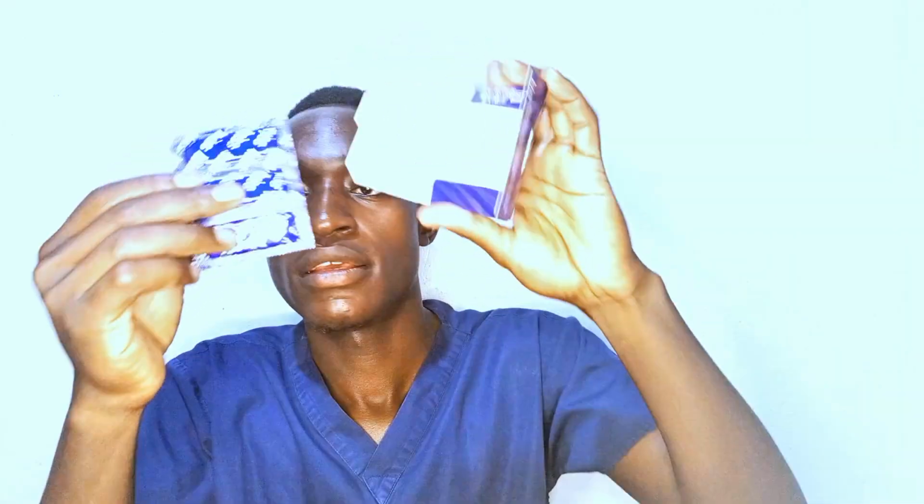On this third type of condom, the expiry date is written here in white, and I'm sure also on the condom inside. So this one is hard, I can open it. It also has expiry dates written here in black.